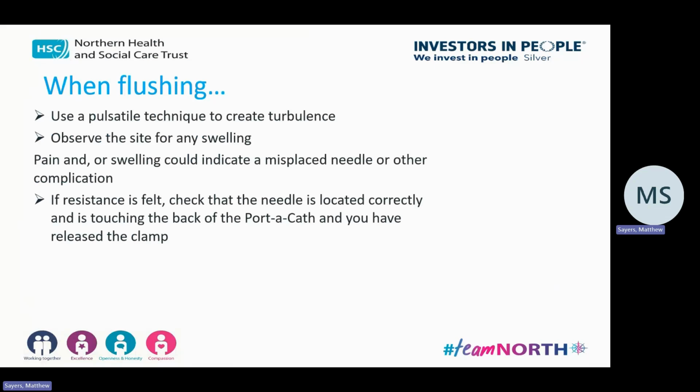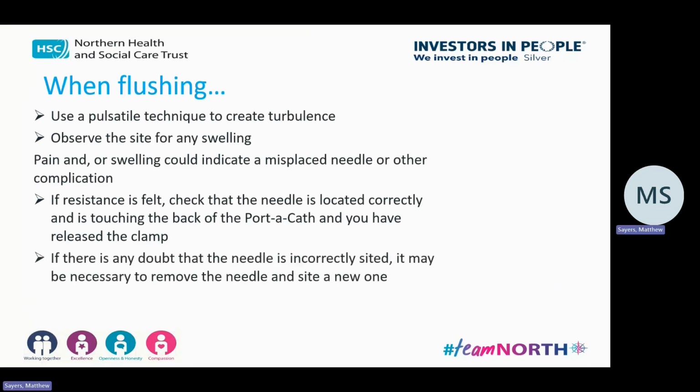You don't want to hammer it in, but you want to have connected with the back of it. But if there's any doubt that it's in the incorrect site, you can remove it and site a new one.